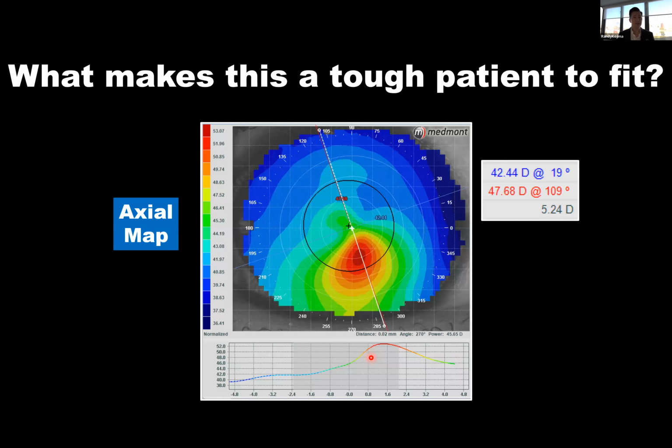So then when we face the keratoconic or the irregular cornea, why is it that we have more of a challenge with this eye? Is it because the eye is steeper? Is it because the eye may be more astigmatic? Really, it's because the eye, of course, is asymmetric. So this hemisphere doesn't match as a mirror of the inferior hemisphere. So one side of the cornea is just not at all similar to the other side. And the same thing is true laterally as well.